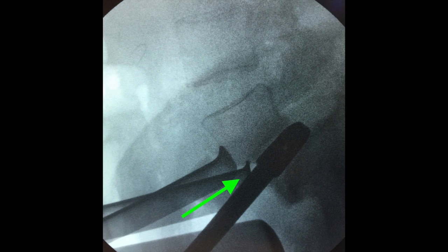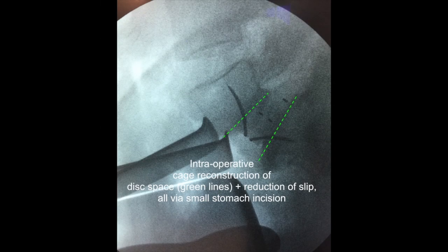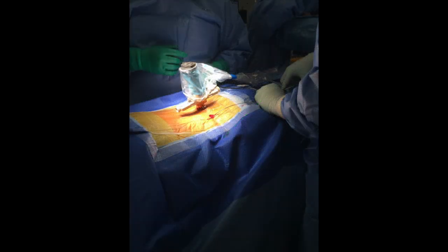Stage one was to take out the disc and put in a nice large cage with solid anchoring, giving her a new disc space.